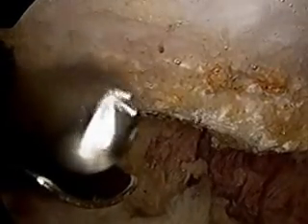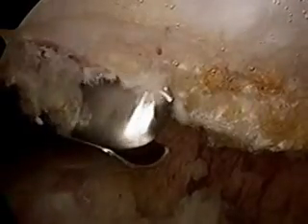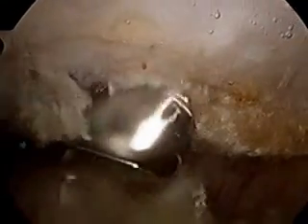The final step in most of our rotator cuff repairs: a lot of times people will develop what's called a subacromial spur, or extra bone on the underside of the acromion. Here we are shaving that down. If we don't shave that down, what will happen is that acromion bone will actually impinge on the repaired portion of the rotator cuff.